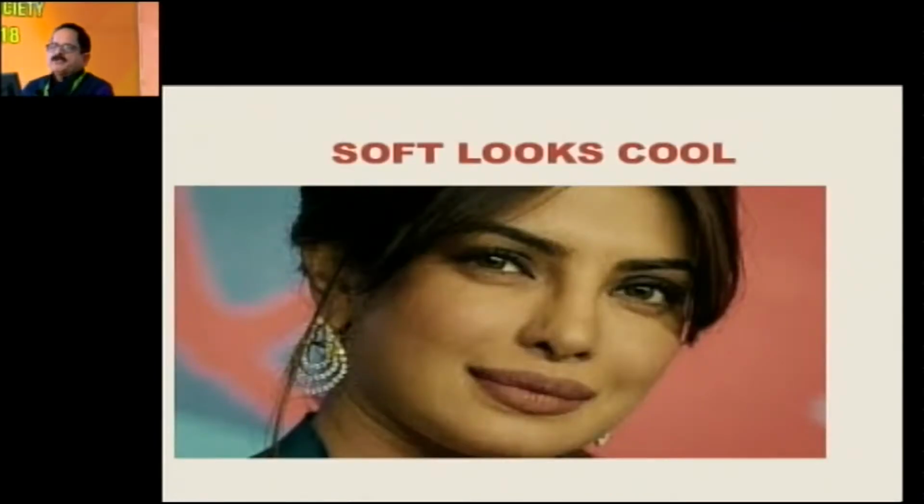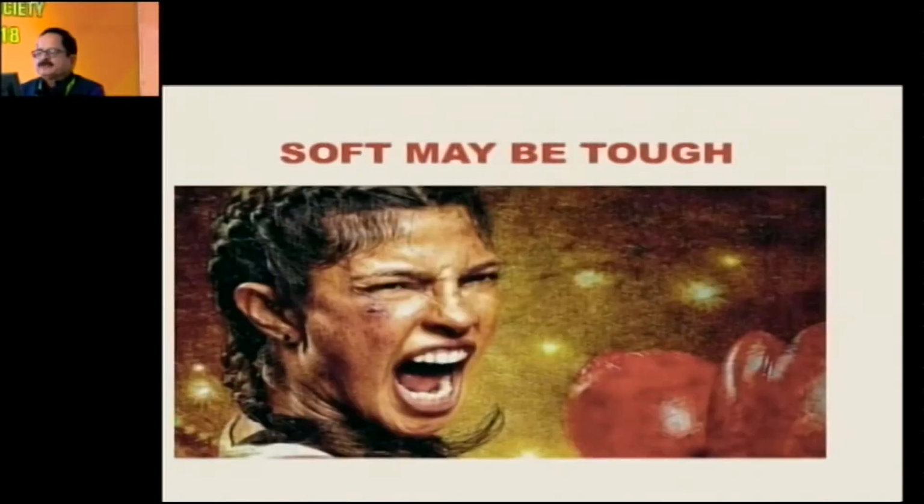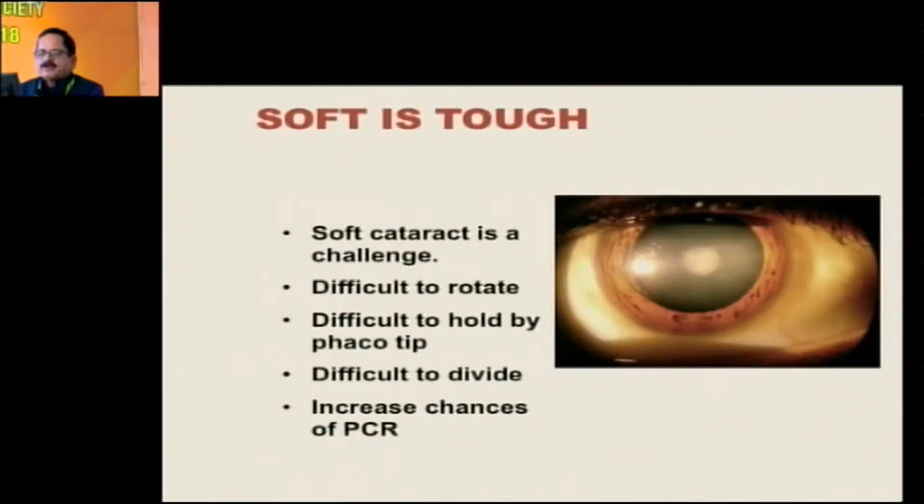After seeing these hard cataracts and white cataracts, you would think that soft cataract may be a very easy choice to do. But soft may be deceptive. Soft may be tough. So soft cataract is a challenge. The reason is that it's difficult to rotate, difficult to hold by phaco tip, difficult to divide, and there are increased chances of PCR in these cases. So don't take it lightly.